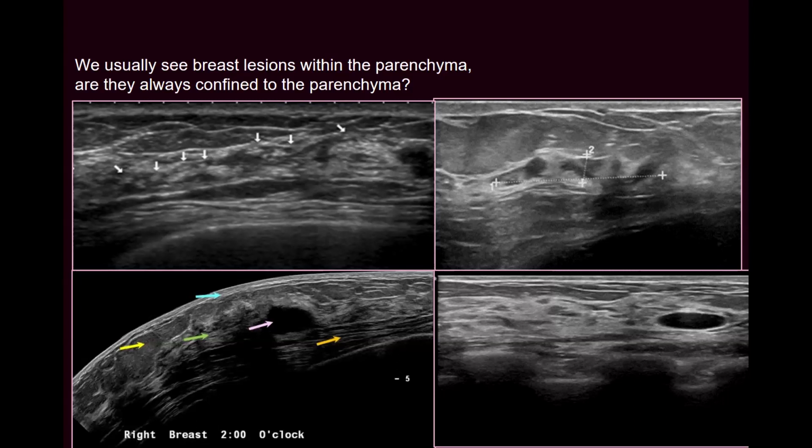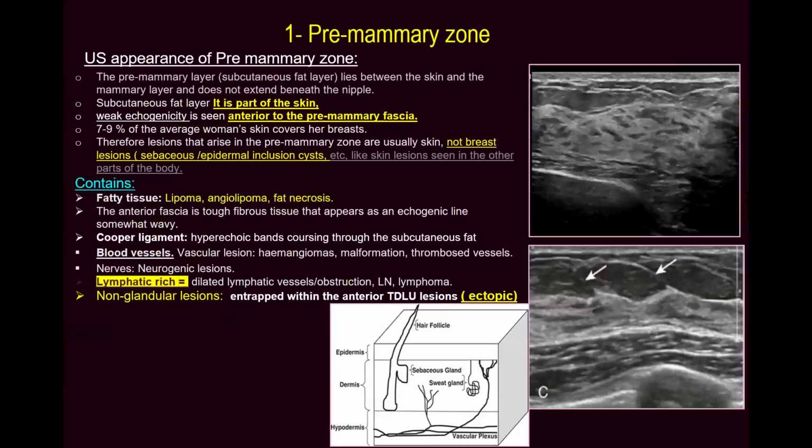We discussed the subcutaneous fat before. We mentioned that subcutaneous fat is part of the third layer of the skin. You remember this illustration before?